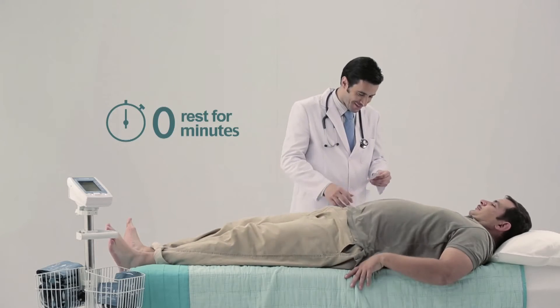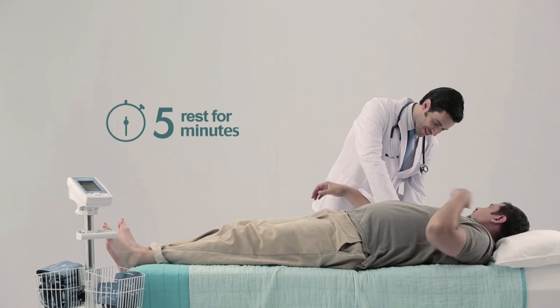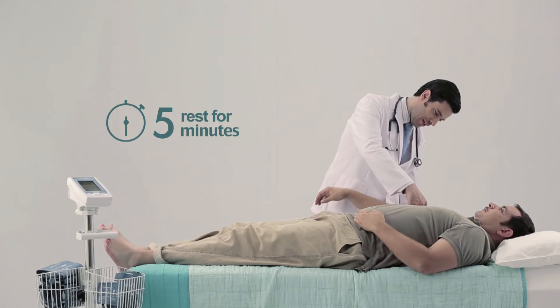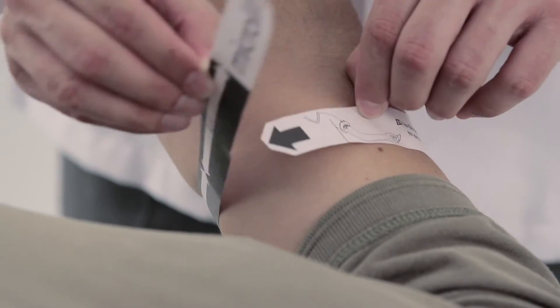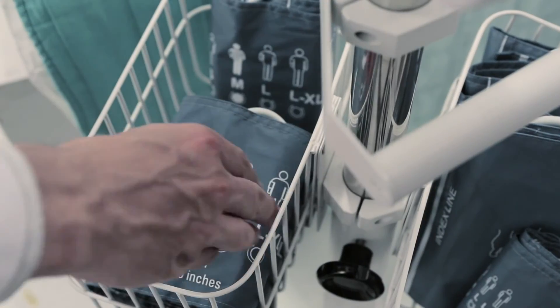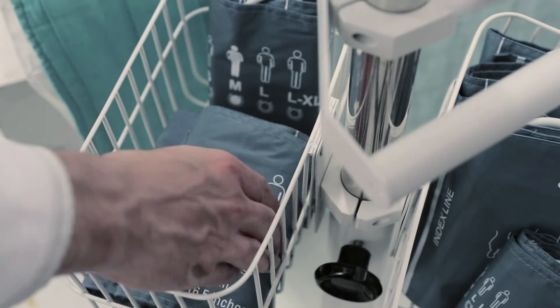The patient should lie down in a supine position to rest for five minutes before taking the measurement. A clinician should take this time to choose the correct cuff size and to perform a double arm blood pressure measurement.